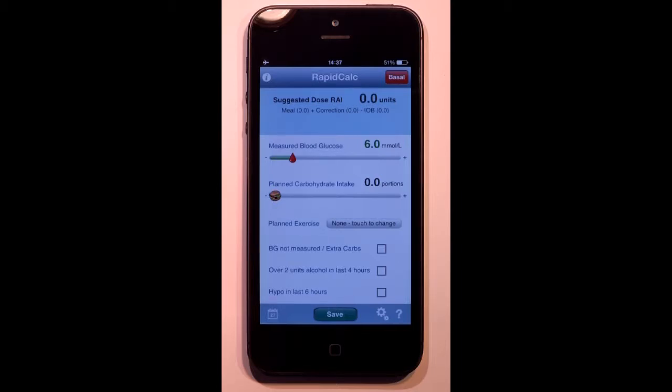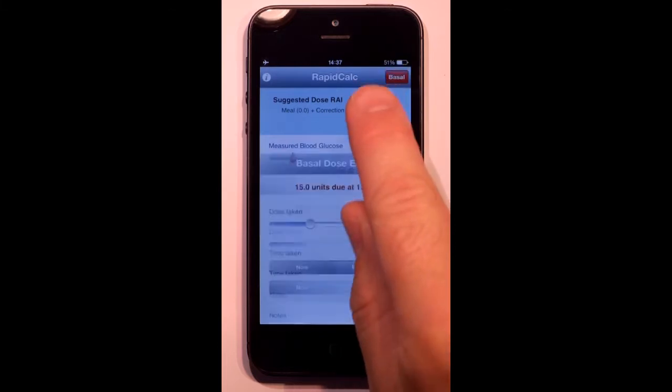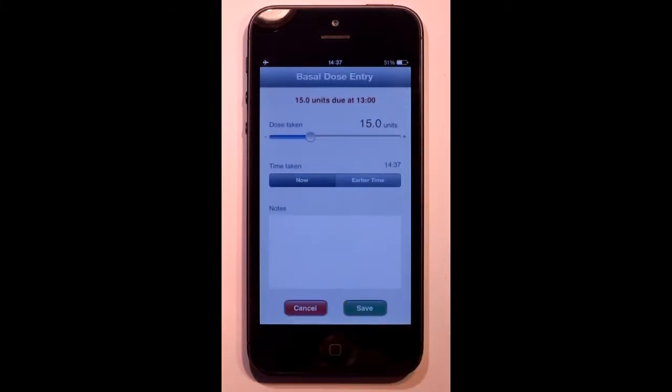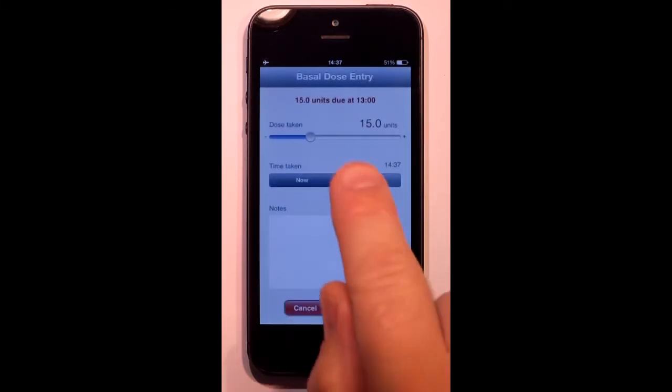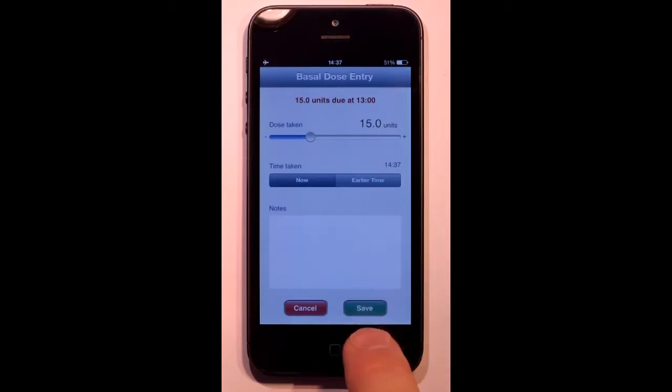Let's start with basal or background dosing. RapidCalc reminds me when the dose is due. The dose is preset and all I have to do is save.